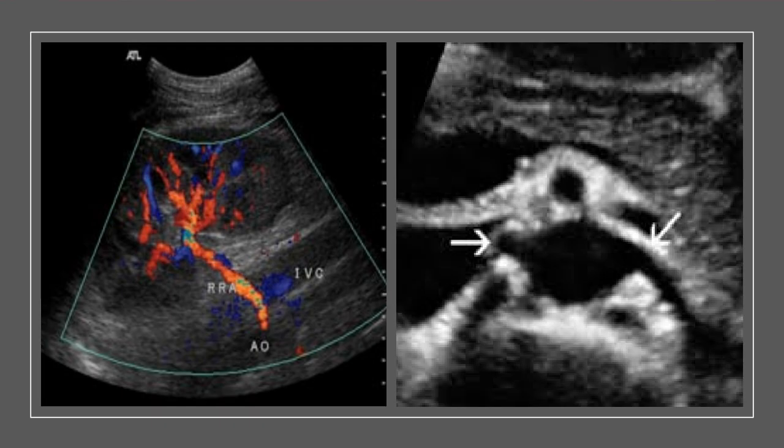And here we just have some nice, pretty images for you to see that renal artery in sagittal. That picture on the left-hand side is just absolutely beautiful. I love this picture. I will use this picture every single year that I teach this class. It's just fantastic. And then transverse, this is what we want to see at that origination with the aorta. We see our right one right here, and then we see our left one coming off.